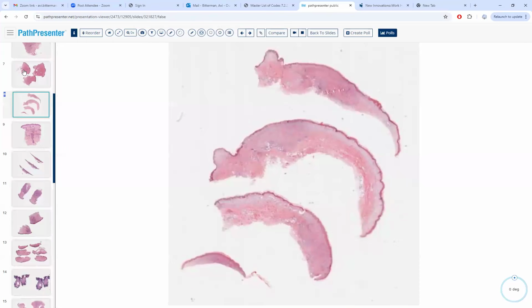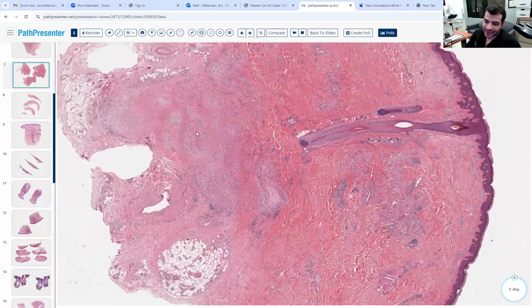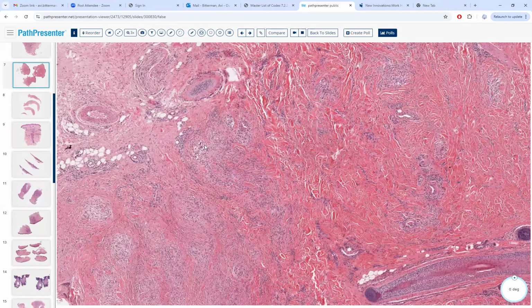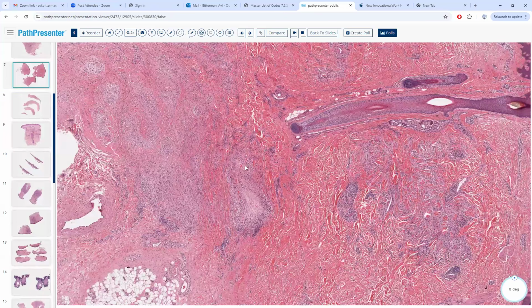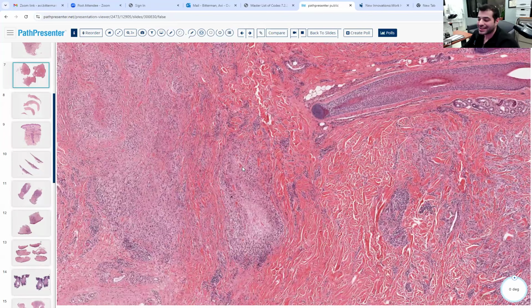Avi, can I ask a very, very basic question? How do you know your question's basic? Maybe it's really advanced. It's extreme. I'm embarrassed to ask it, but what exactly is the definition of palisaded granuloma? Is it just referring to the way that the histiocytes are lining up, or what is it actually? Yeah. So they are lining up and they're walling something off over here.